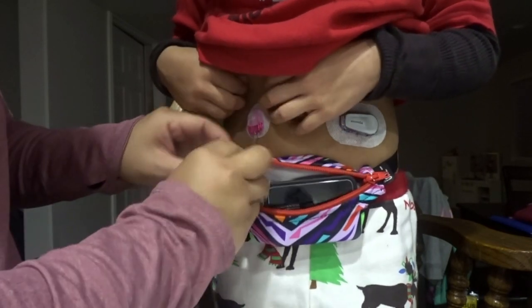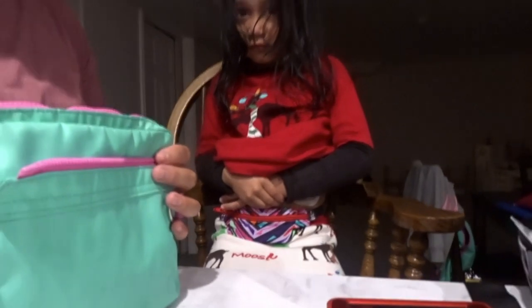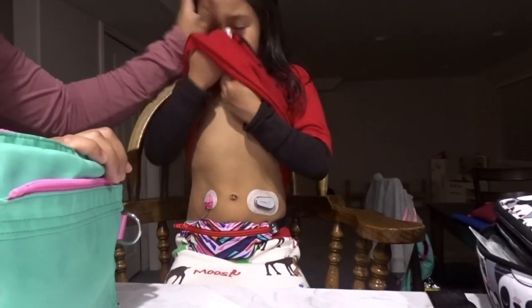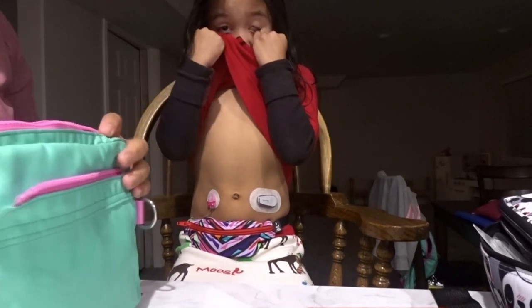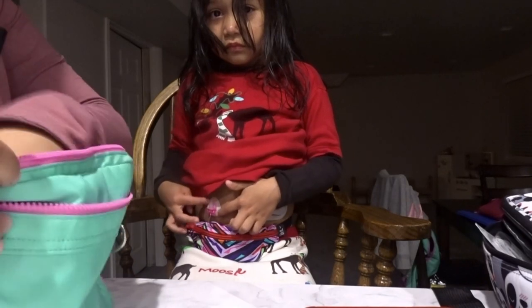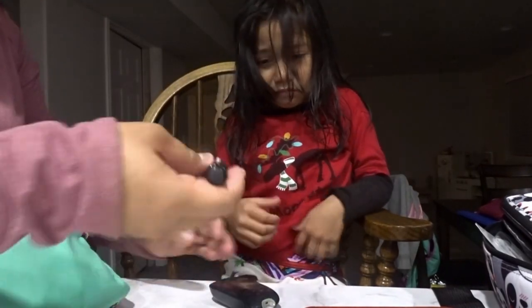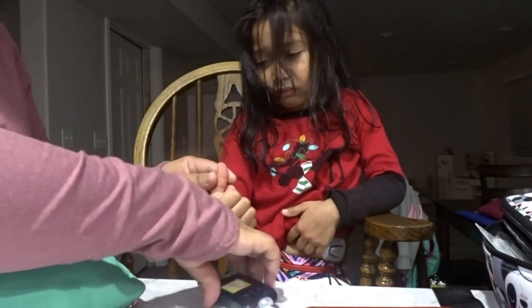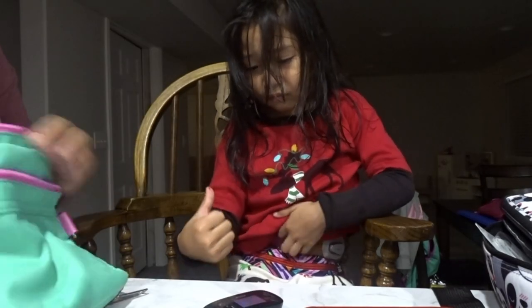Let's check her sugar because I think it might be low. Let's do one more thing - check her sugar - and then we can throw all this trash away. You're going to have a cookie right after. Her sugar is 94 - she's okay!